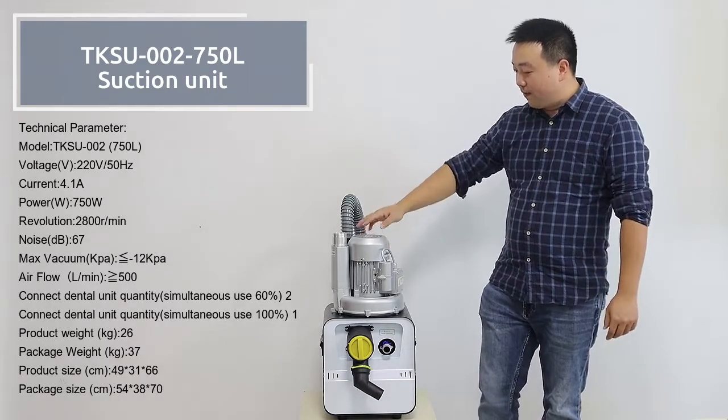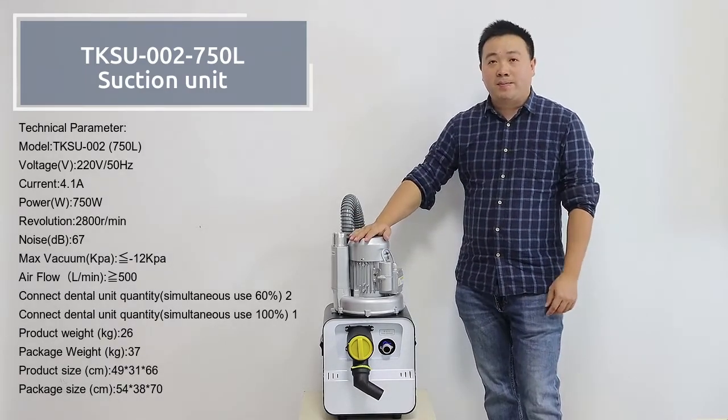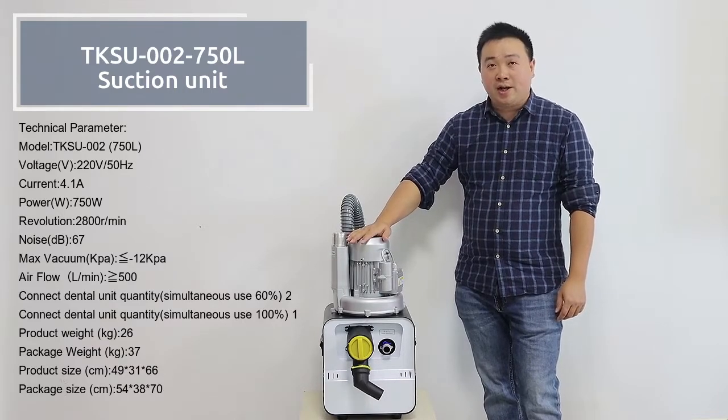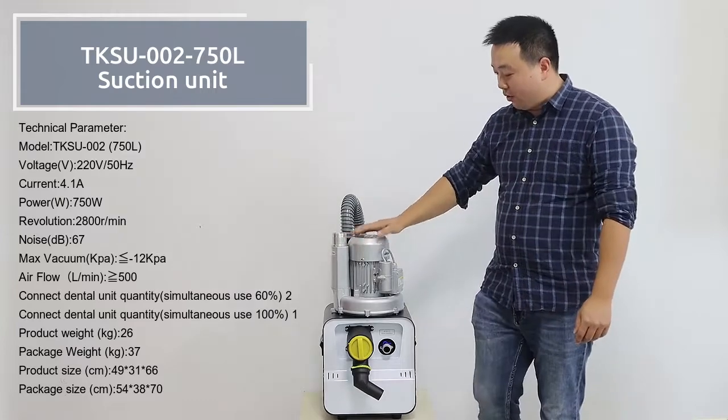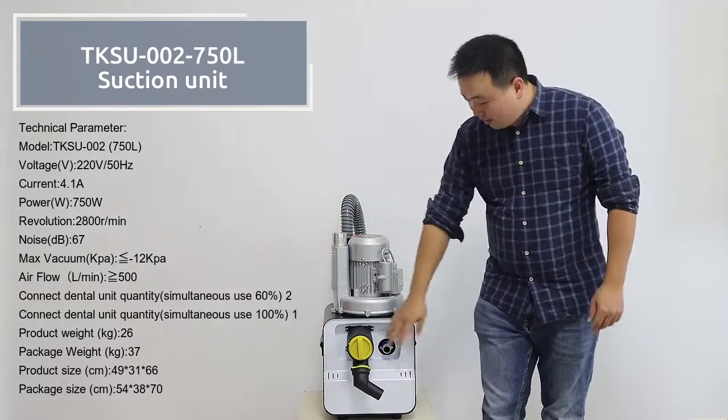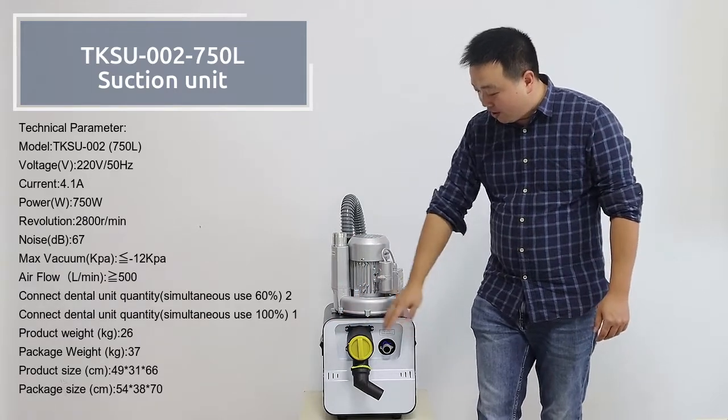First, it is a high quality unit. Most of its components are sourced from the South of China, and all the machines come with a one or two year warranty.